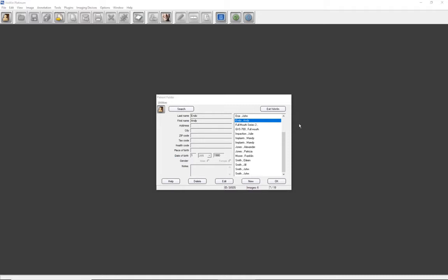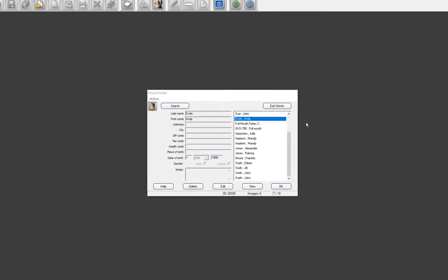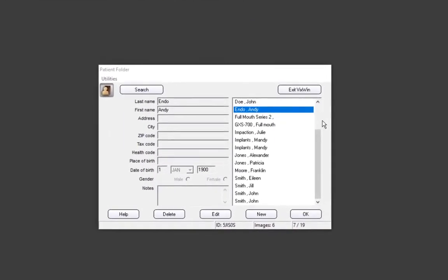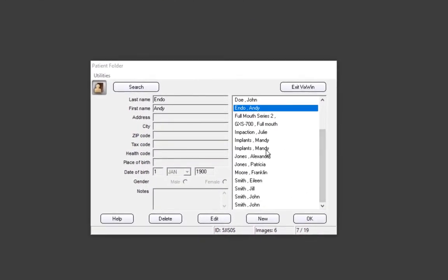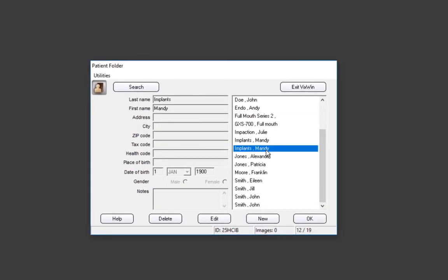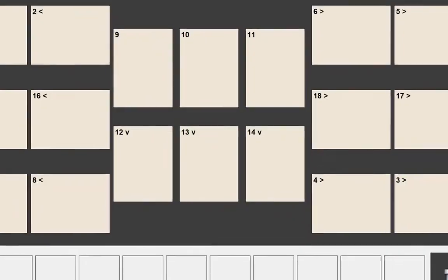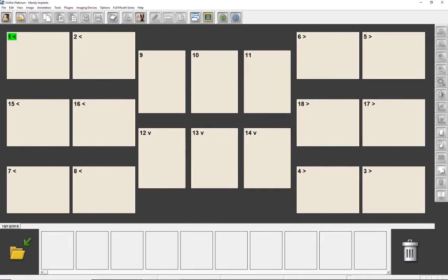When the desktop icon is double-clicked, VIXWIN will open to the patient folder window. Let's double-click on a patient, or select a patient and then select OK to open the user interface. In this example, the interface opens in the full mouth series mode which was used with the previous patient.